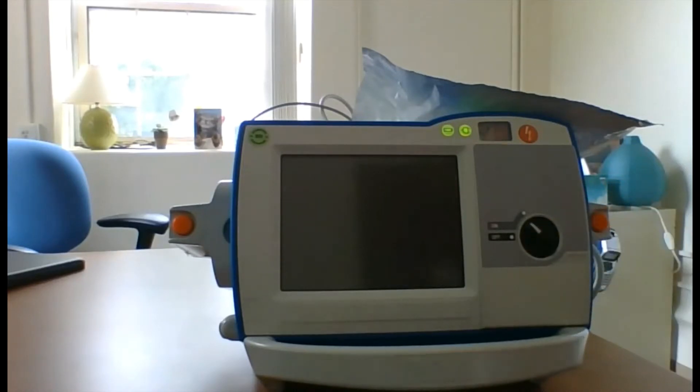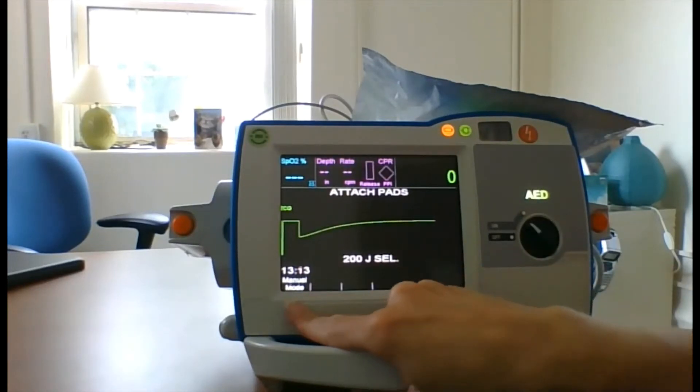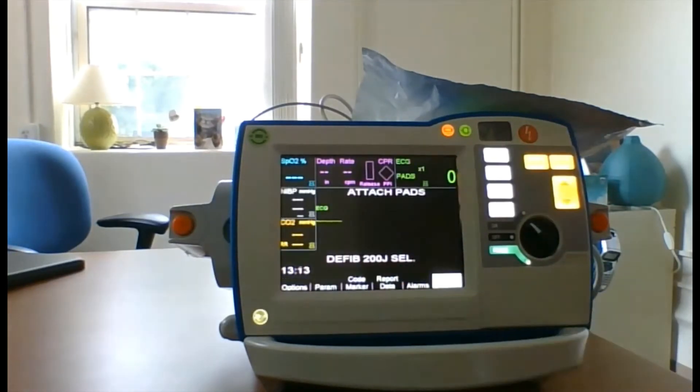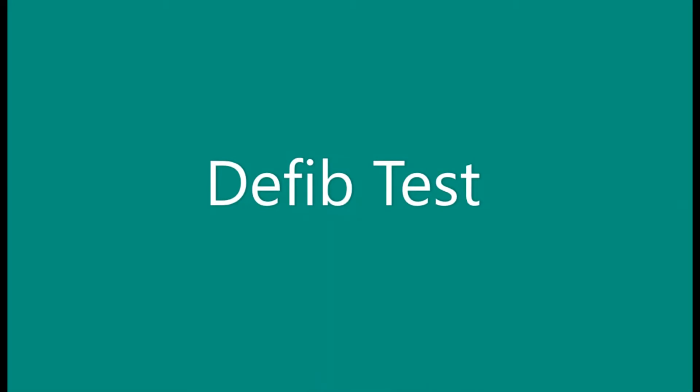Turn the machine on, then select manual mode. After selecting manual mode, you'll see that the buttons are illuminated and now you can perform the defib check just like the ALS model.